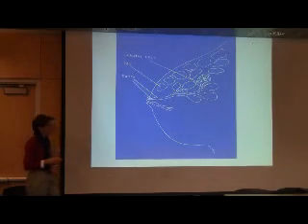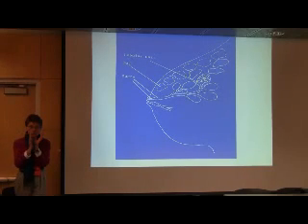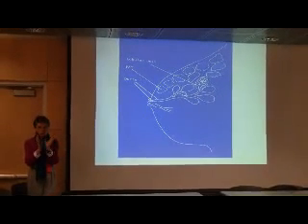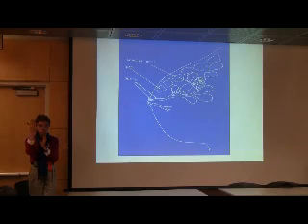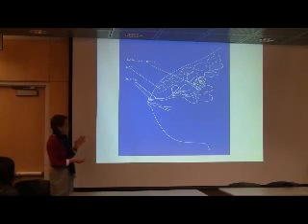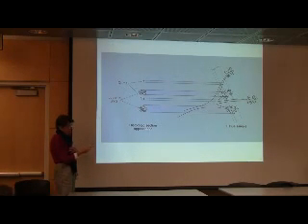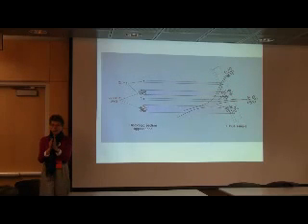But what I wanted to start with is to try to translate the view from the three-dimensional, what you think of as a breast with the tree that clearly has 3 dimensions to it, to the 2 dimensions that we look at in the microscope, which is quite a different view. So next, say we have one of these branching structures here, and then we take a piece of tissue out of that area, and the orientation of that is going to be random.